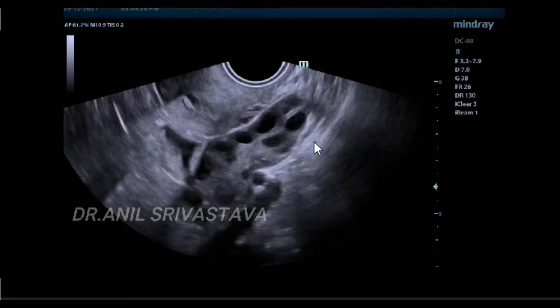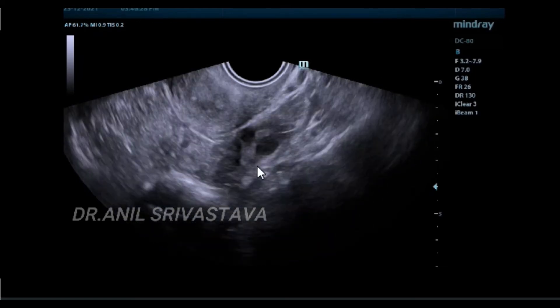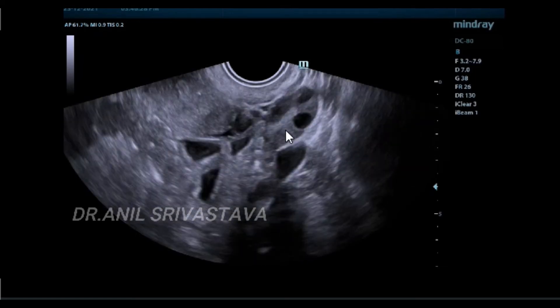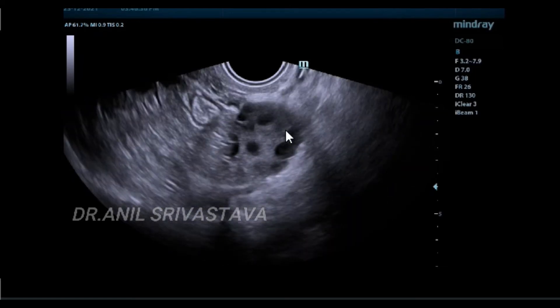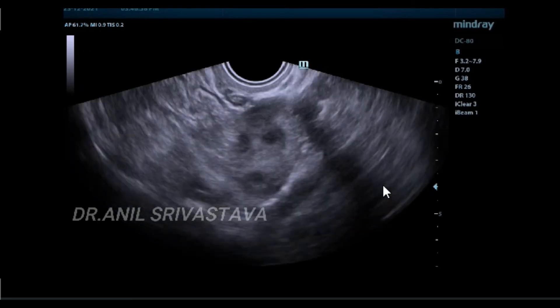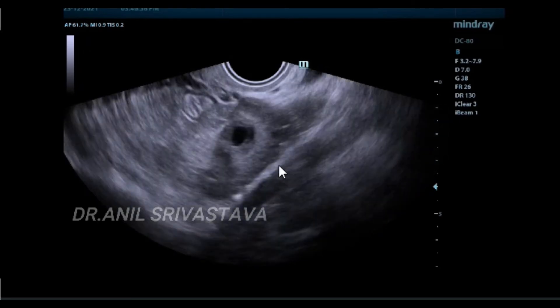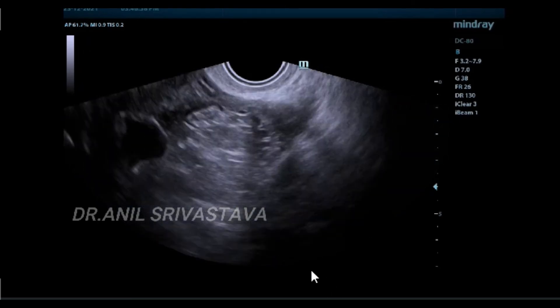This is the ovary — one ovary, the left one — and the other, the right one.